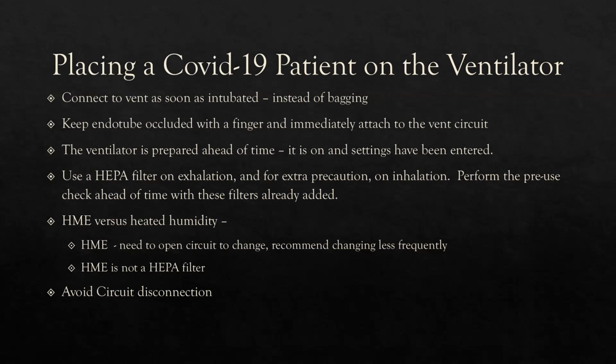You want to have the ventilator prepared ahead of time, have it on, have settings entered, so as soon as you connect, you would go from standby to ventilate. Use a HEPA filter on exhalation. That's a given, right? And then for extra precaution, you can use a HEPA filter on inhalation. I don't know how that helps. Perform the pre-use check ahead of time with these filters already added.